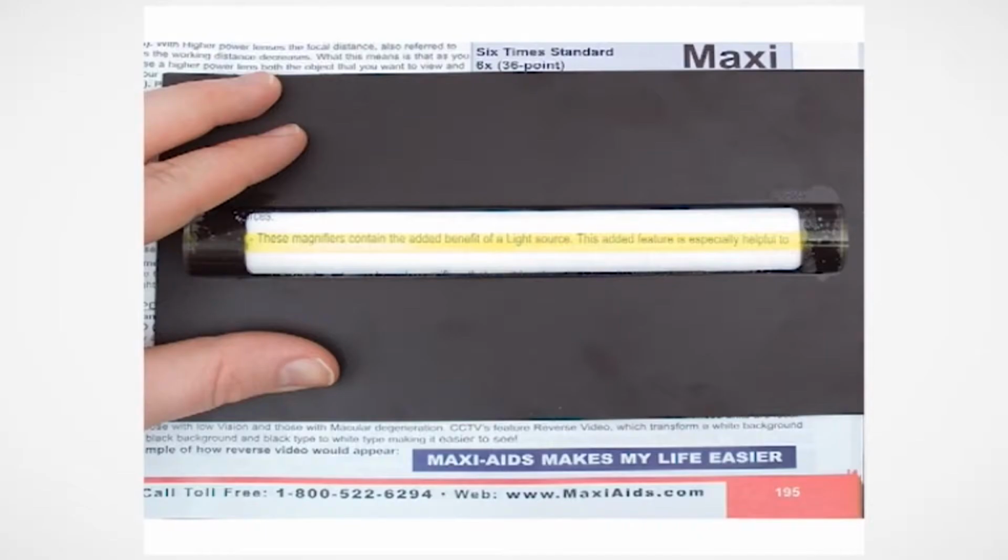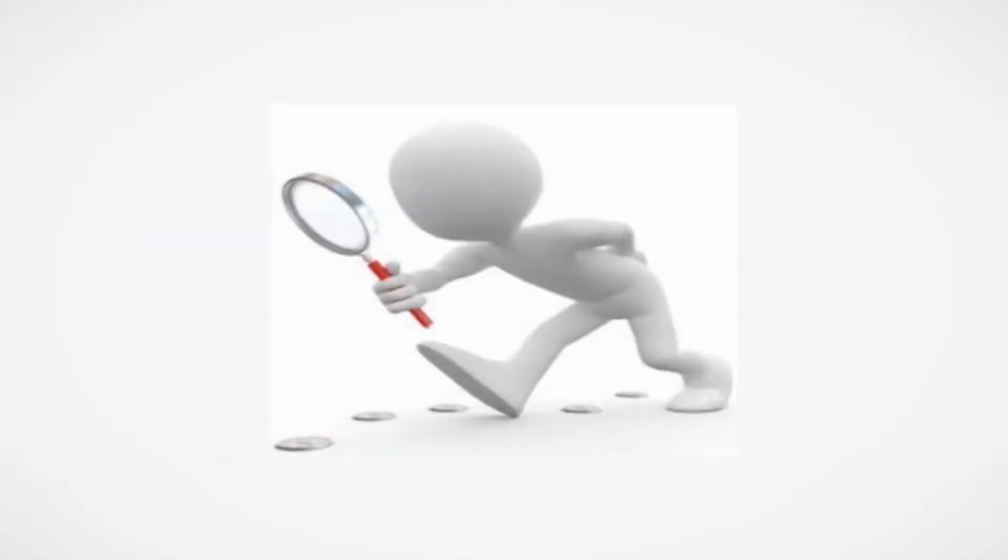Typoscope. A typoscope or reading slit is made up of a black cardboard with a slit in it. It is used for blocking out all but the print viewed through the slit. It should be black so that the light from the page will not get reflected. A typoscope assists in finding and keeping the place on the page of the print.